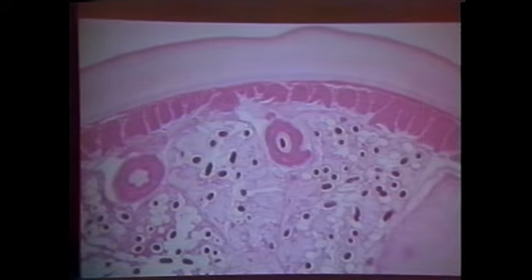And if you look inside the worm, you can find massive numbers of eggs, which you will later find are characterized as being small, oval, thick-shelled, and containing an embryo or a larva. Okay? So we call them embryonated eggs, not larvated eggs. A larva is outside. The embryo is inside the egg. It's just a tiny little thing. But anyway, the musculature is coelomyarian, very thick cuticle, large lateral cords, and the intestine is not unlike the ascarid type that has columnar cells. It is often folded on itself and sometimes has a microvillar border.